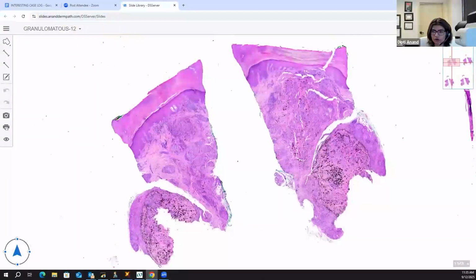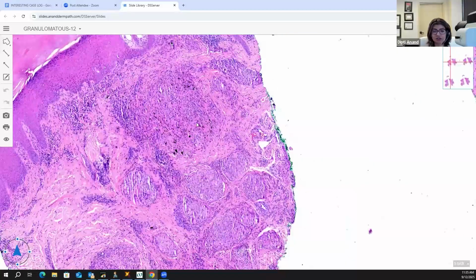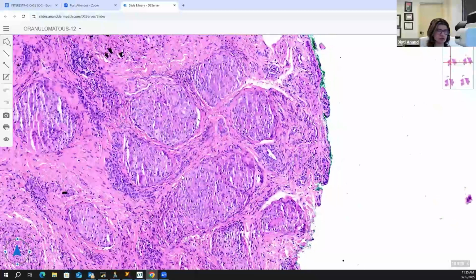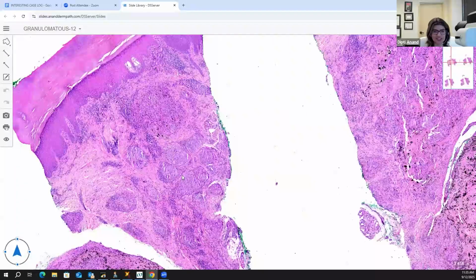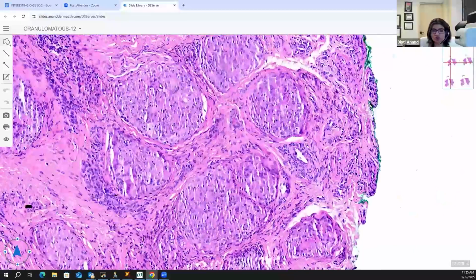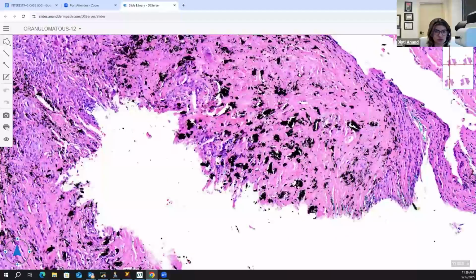So sarcoidal granuloma from a tattoo. And it's important again. This is one thing which really ticks me off when people say, oh yeah, this is tattoo reaction. No, you have to mention it's a sarcoidal granulomatous tattoo reaction because that has a specific implication. So you do need to mention that it's sarcoidal granuloma from the tattoo, which is very obvious in here.